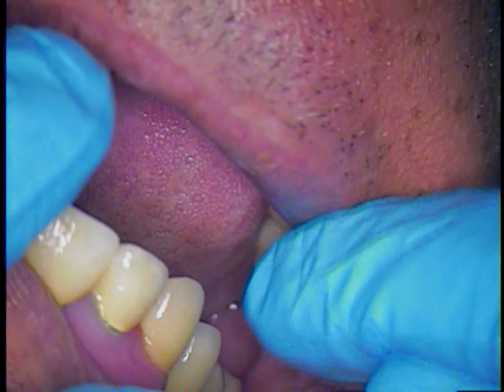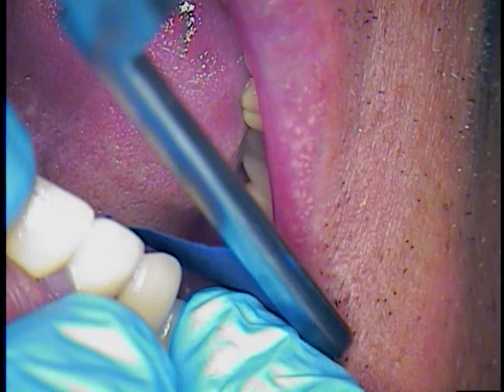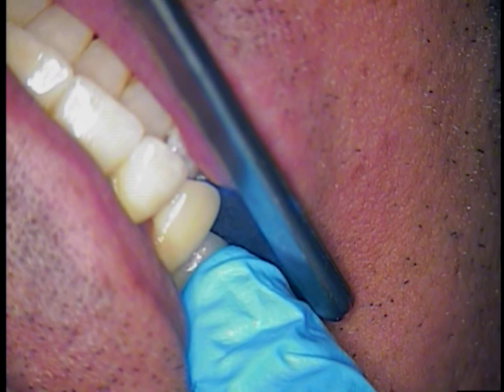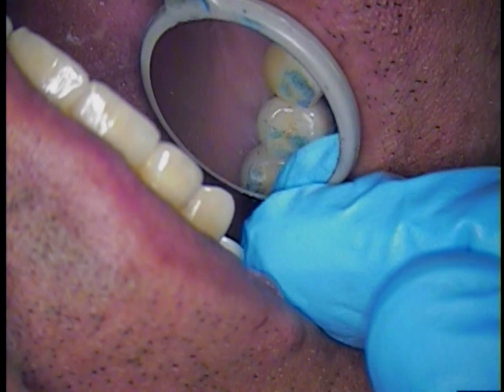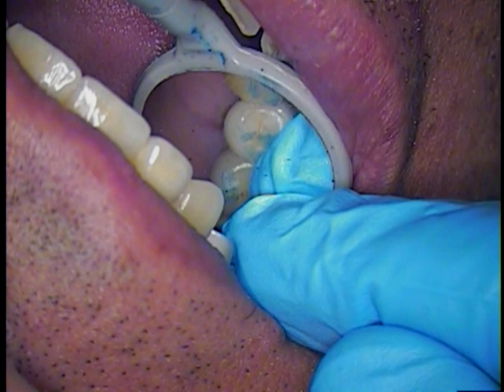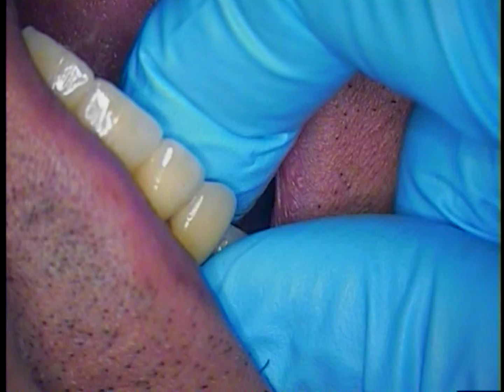Occlusion is important. In his case there is a canine that is also in occlusion with the next three implants — numbers 3, 4, and 5. So number 6 is helping with the load. But look at the movement of the crown itself. We are going to shallow the bite on that tooth and allow it to have less movement and less contact in lateral movement. I am having him squeeze down on thick articulating paper to accomplish this.